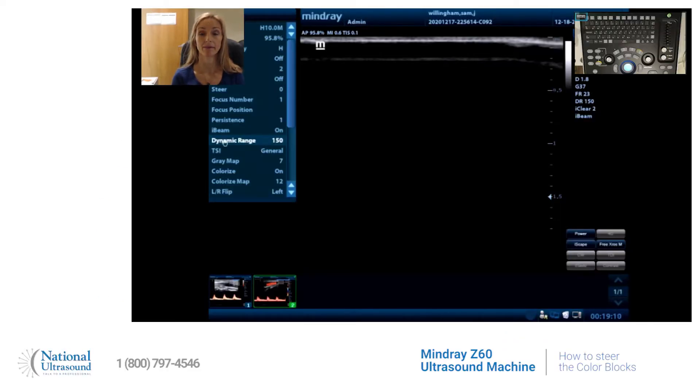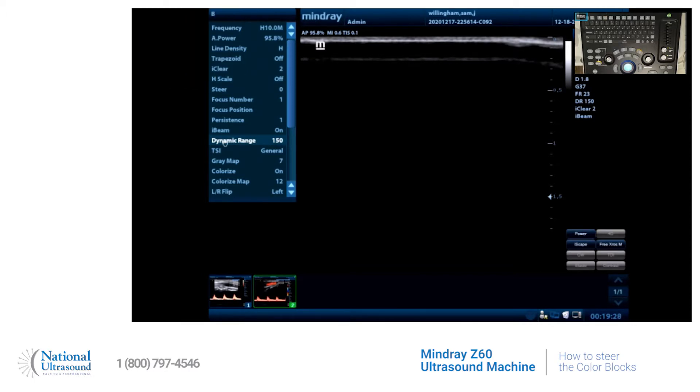Hi, my name is Sam Willingham. I'm a registered vascular sonographer and a registered cardiac sonographer. Today we're working on the Mindray Z60, and the probe we're using is the 7L4P. I want to show you guys how to steer your color box.